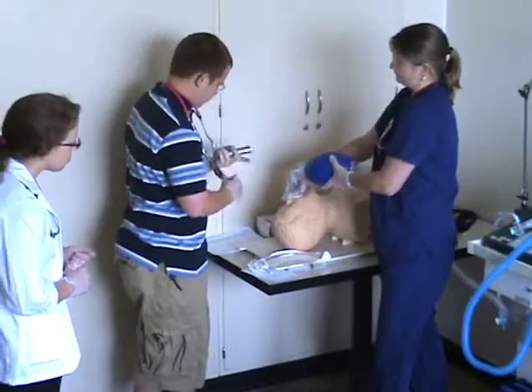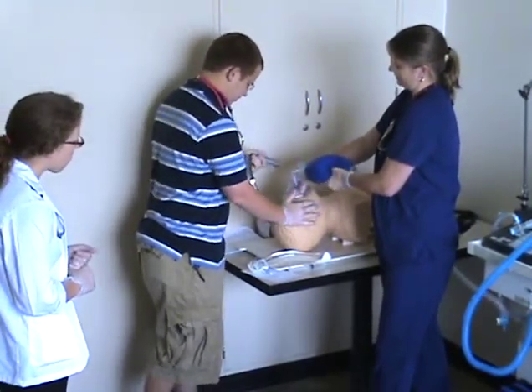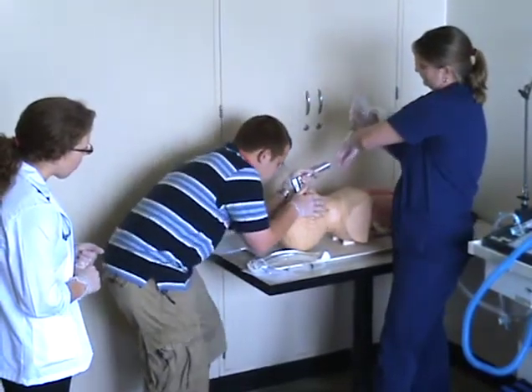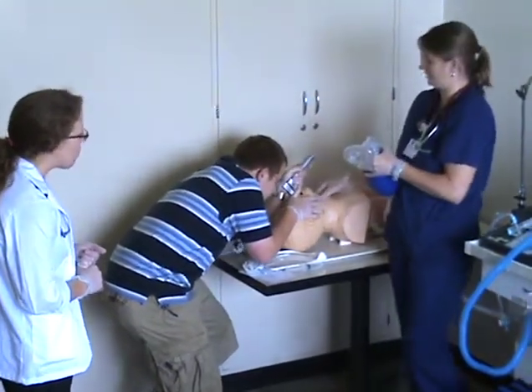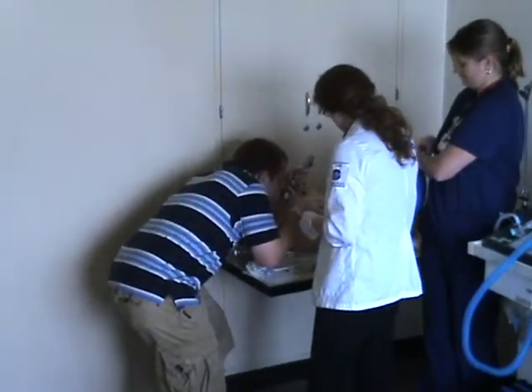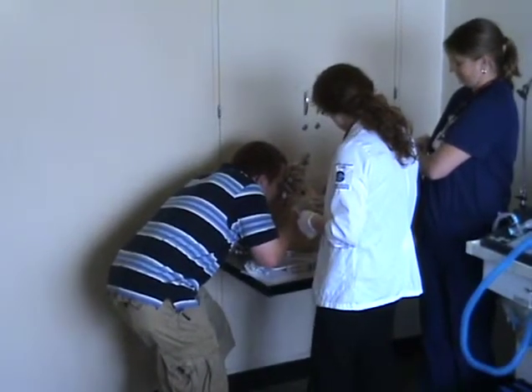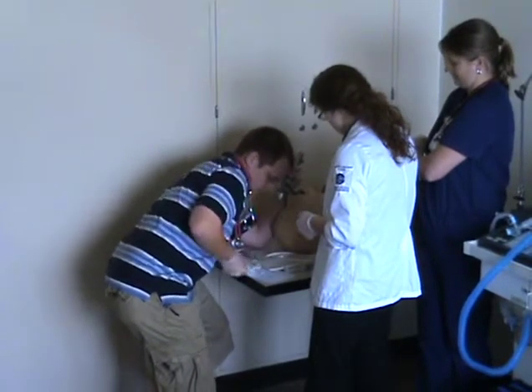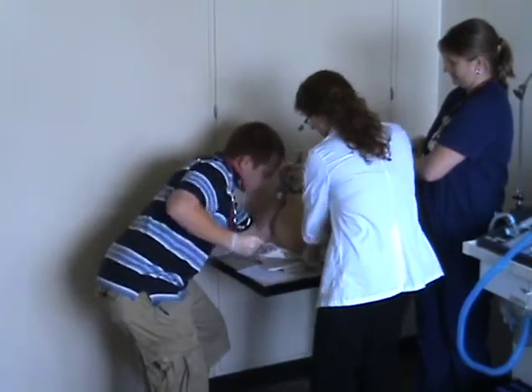This is really too large, but I'm ready. If you want to come over and apply cricoid pressure, right here. That helps the respiratory therapist visualize it a little bit better. Can you hold this?